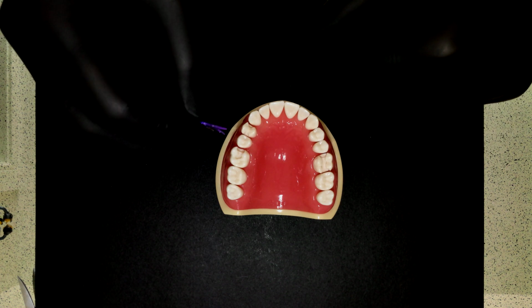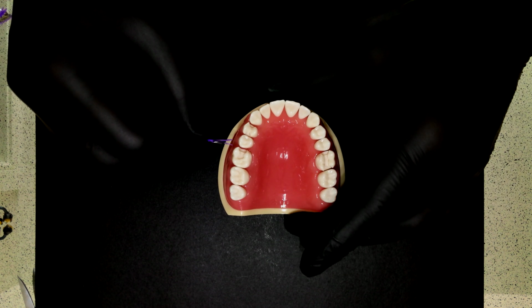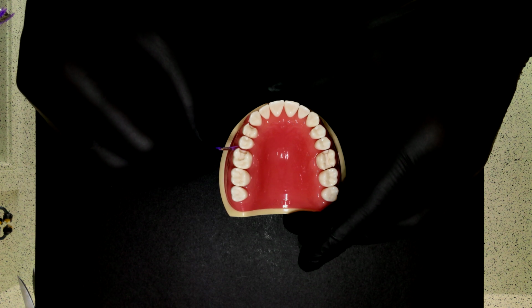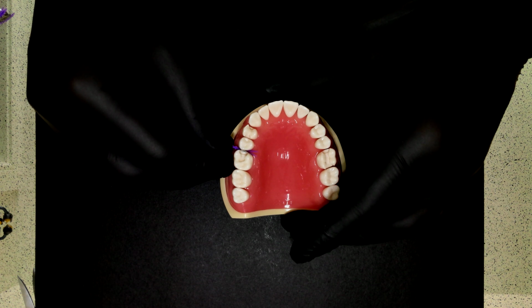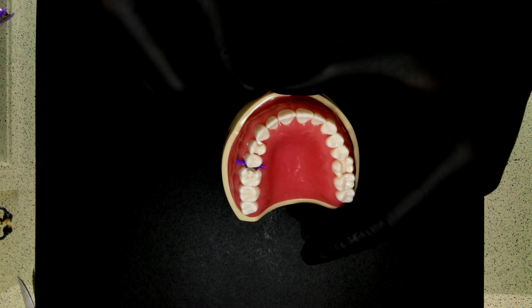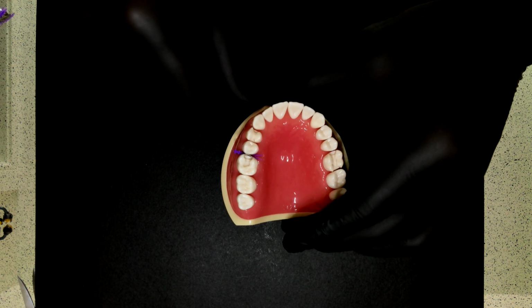And so in these isolated class 2 events, I'll just show you how it goes. You're just going to place the splitting wedge mechanism, and it's best to take one of the wings and press it against the tooth, and then slide it gently into place and apply pressure like so. And there you have it, a wedge and matrix in position in one fell swoop.